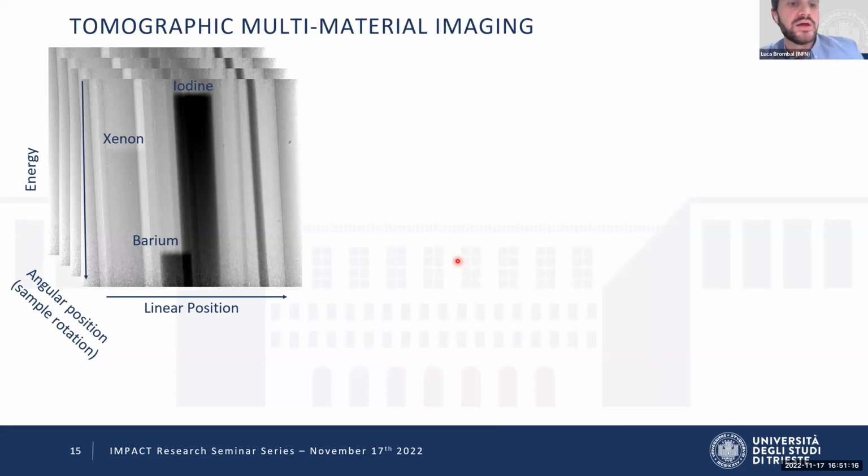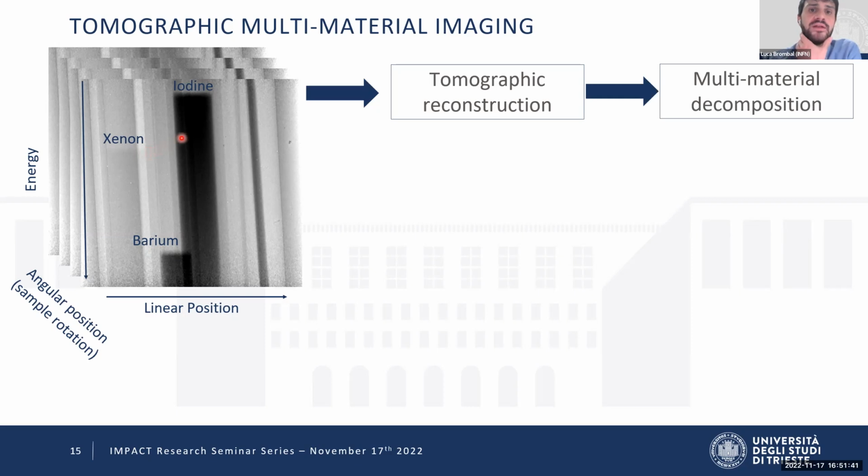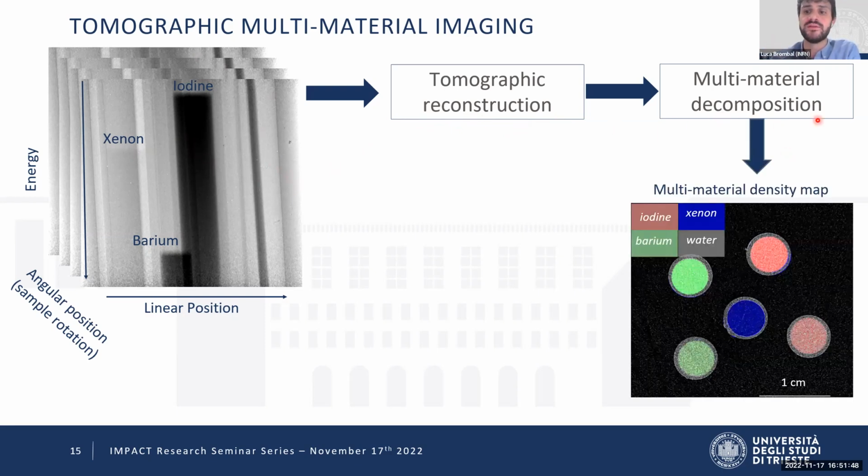And of course, since we've got such a big energy bandwidth, we decided to target 3 K edges simultaneously of 3, let's say, clinically or biologically relevant contrast agents. So iodine, barium, and xenon, and we performed tomography with that. And here we are still in the phase where we are doing a feasibility test with a simple cuvette. But you acquire all the images, all the projections, you perform tomographic reconstruction, then multi-material decomposition, and then you end up with a slice, so with a tomographic view of your sample, where you could uncouple 3 materials, so all the 3 contrast agents plus the embedding material that in this case is water or plastic. It really doesn't make a difference.